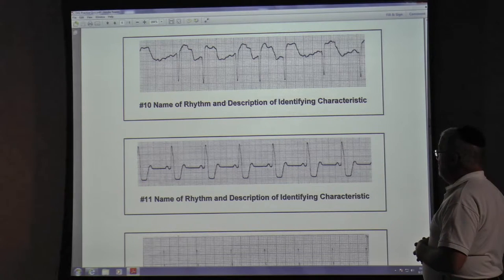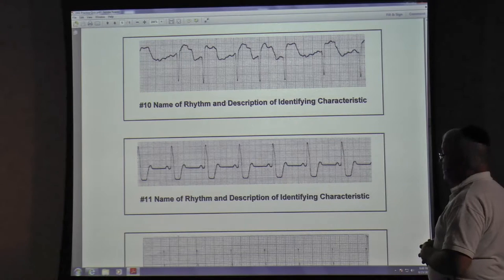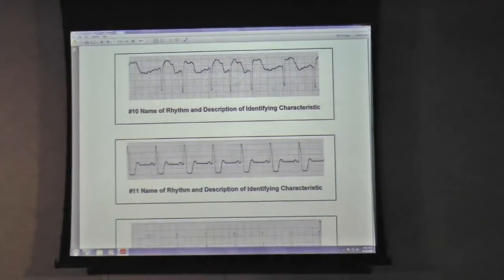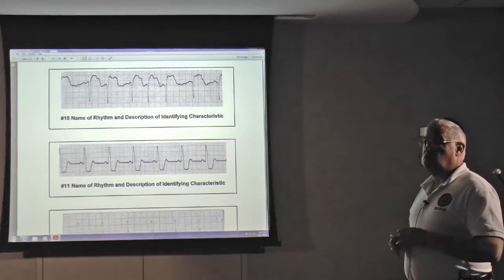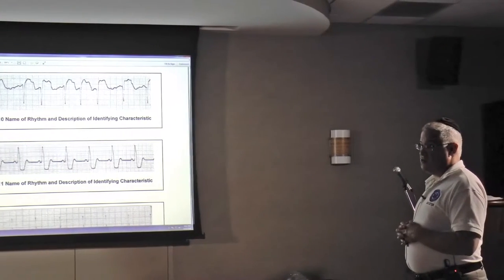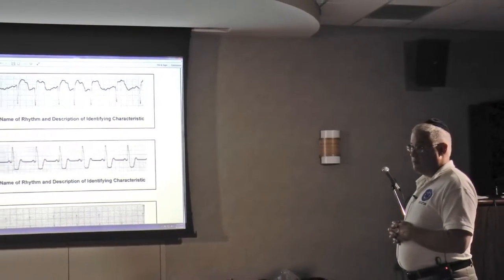Not atrial flutter. It looks like it's not quite sawtooth. Right, it's irregularly irregular. That's the good term. Totally irregular or irregularly irregular, which means that there are no constant P waves, no regular atrial activity, and then the R to Rs are totally irregular. So if you can't pick out any clear P waves, now I'm not talking about maybe once in a while you see a P wave, but you can't consistently pick out P waves, and the R to Rs, the ventricular, is totally irregular, by definition that would be atrial fibrillation, okay?